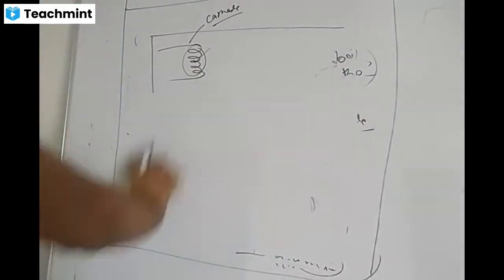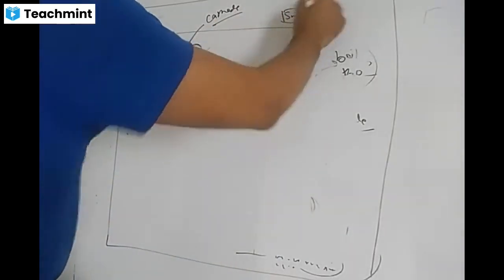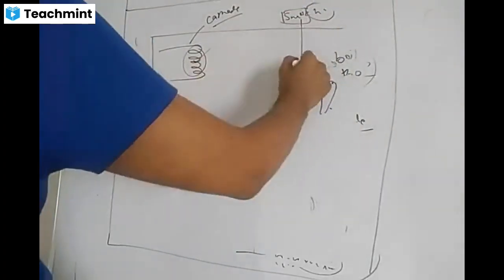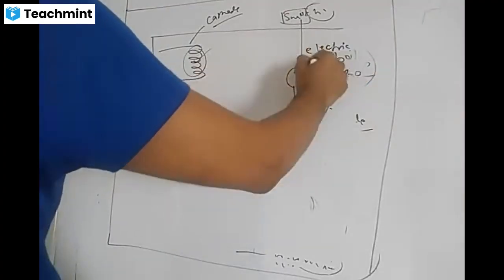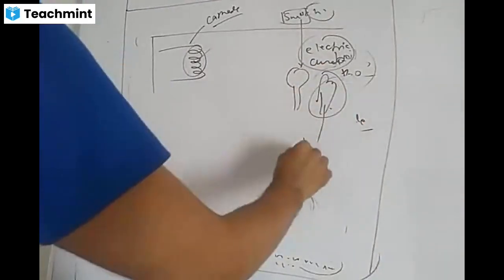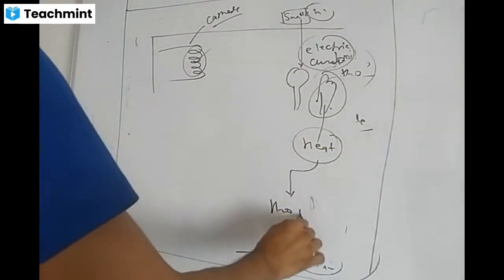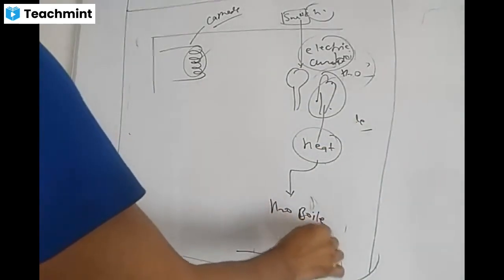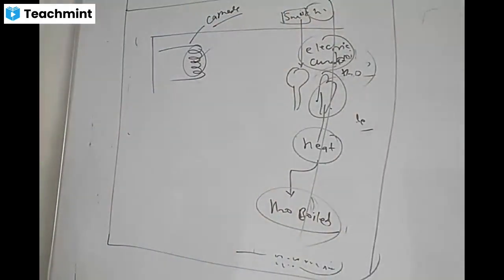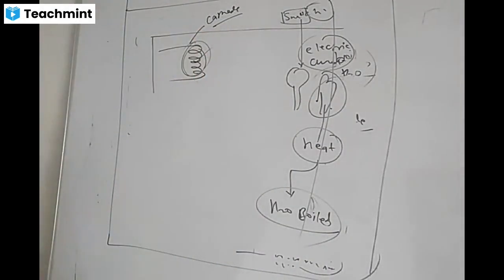In case of the bulb and the electric rod, when we switch on, what we are giving to these structures is electric current. That electric current will heat your electric rod, and because of that heating, your water becomes boiled or heated up. So this mechanism is followed in case of the electric rod and bulb. The same mechanism is occurring in case of this cathode filament also.